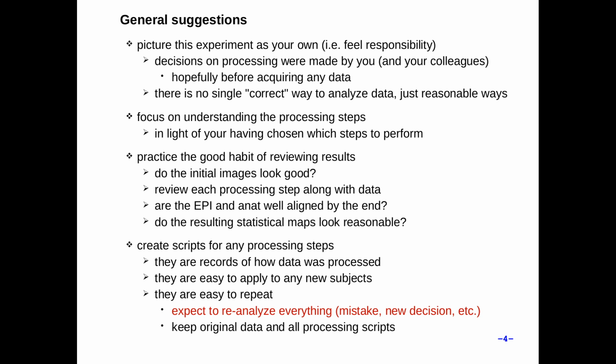You might update the software regularly, but once you've basically acquired all your subjects, it's a good idea to reanalyze all of them with the current software, one set of software, so you don't have 2 years of data acquisition using 2 years of different software versions to run the analyses. So typically, you'll repeat all of the subjects at the end anyway.